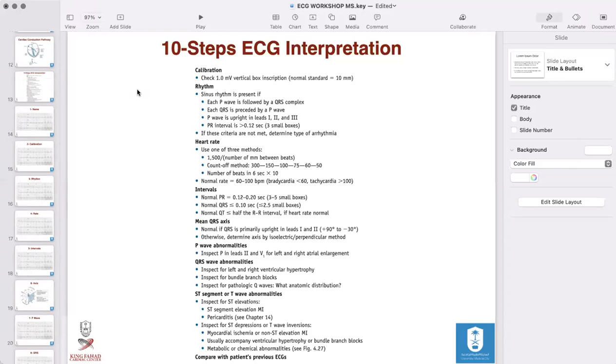ECG sessions, for example, for ER physicians, for cardiology, each one of them, we go really for days. For example, in cardiology fellowship, we really go deep. For example, axis is a whole session by itself. But it's like, you cannot learn all of medical school, for example, in 1 year. That's why you take it over years. The same thing here. What I think is important is the methodology of interpretation and understanding what is normal and abnormal.